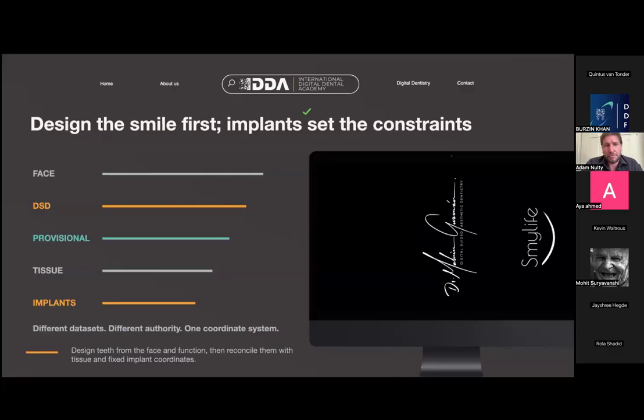But briefly, if we've got the face and the lip line, my personal preference is to go down the road of an FP1, maintain the gingival architecture and keep it natural. These days, with the technology we have, we can use titanium frameworks and either reinforced PMMA or zirconia sleeves on the titanium frameworks, like an eye bar, that would still be aesthetic in an FP1, but also strong enough to withstand the forces that we're going to experience with full arch. And again, a totally separate lecture.